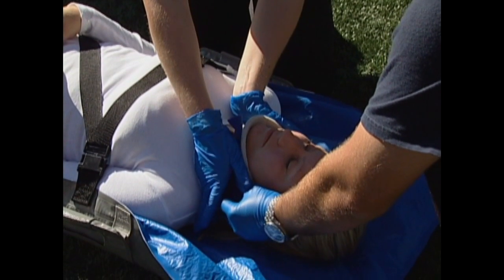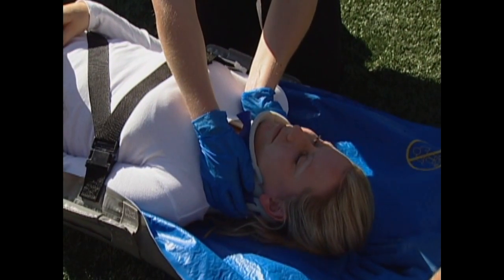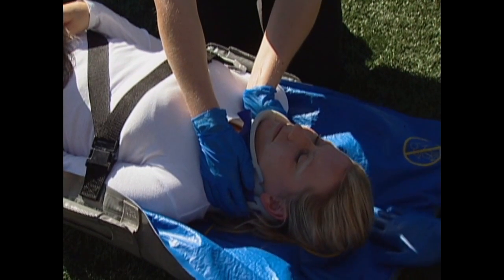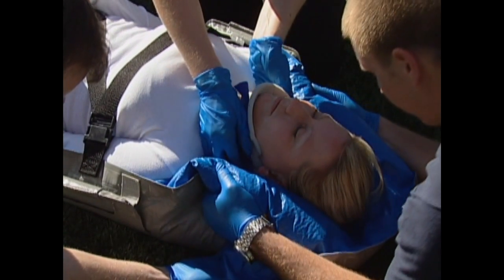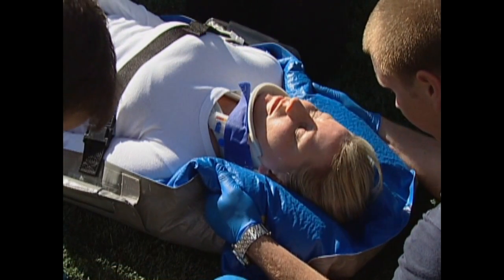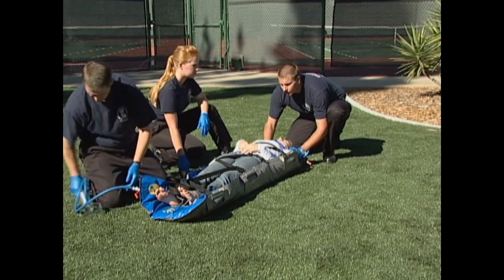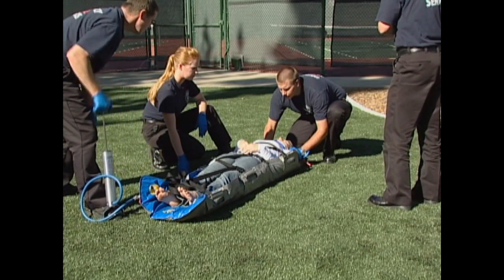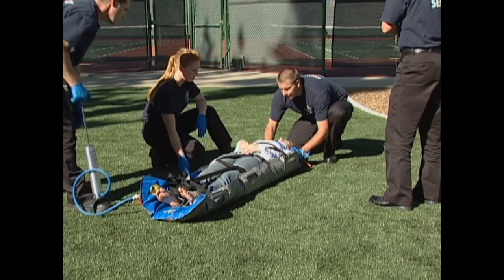Push any beads away from the area above the patient's head, but do not alter the support under the patient's head, which is maintaining neutral alignment. Shape the mattress around the head, making sure to fill the voids by the shoulders and the base of the neck of the patient. Transfer stabilization to the outside of the mattress and continue to hold these head blocks that you have formed until the mattress is evacuated. Evacuate the air from the mattress using the valve located at the foot end. The head end valve can be used, or both valves can be used simultaneously, but it is preferred and recommended to use the foot end valve.